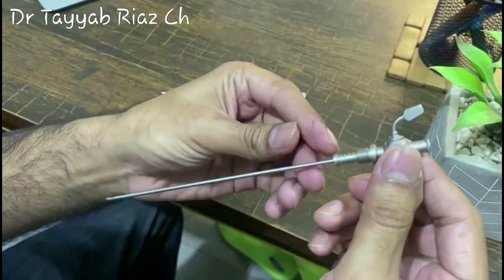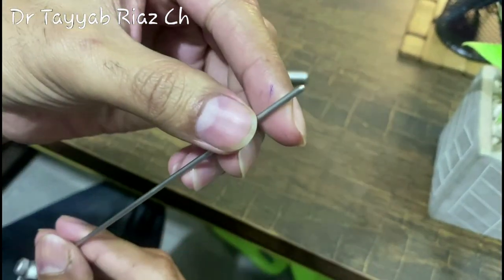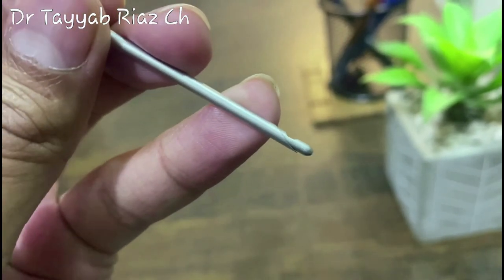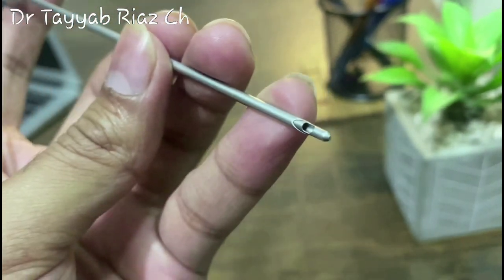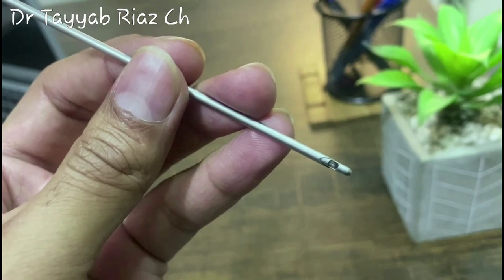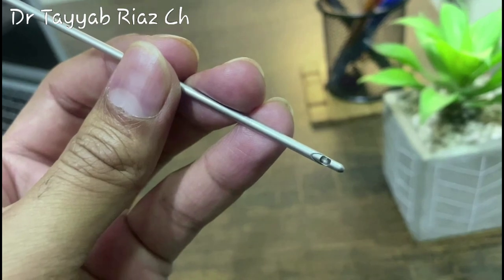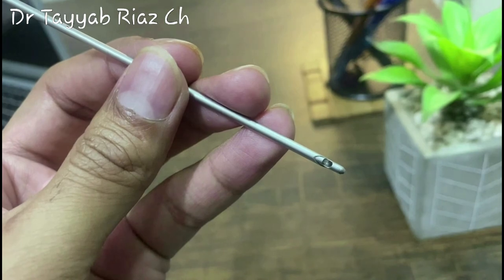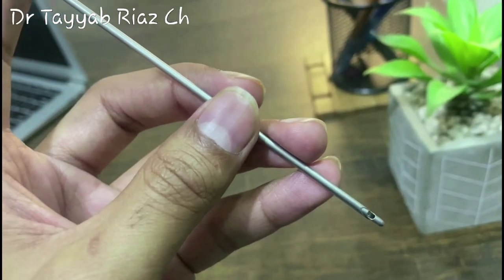This is the stylet. It has a side eye, as is visible near the tip. The tip is blunt. Why is the eye on one side? It is to prevent any accidental insufflation of the intra-abdominal organs or structures that come in direct contact with the tip of the Veress needle, especially the omentum. So the eye at one side is part of the safety mechanism of this needle.